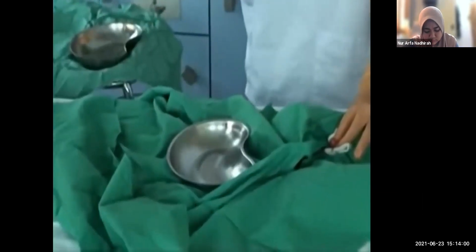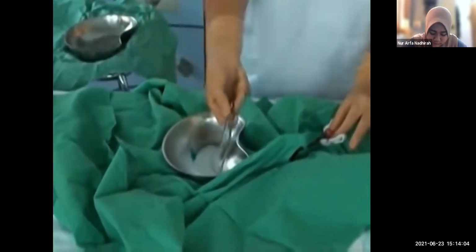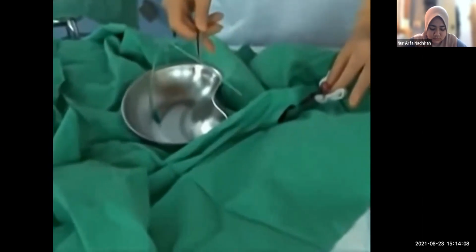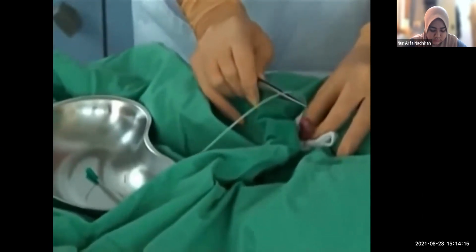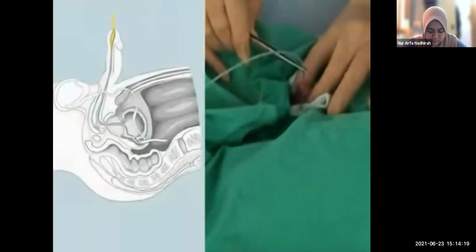Place the catheter in a sterile container within the sterile field between the patient's legs. The entire procedure can be done using your fingers or forceps with your dominant hand. First, we will demonstrate the procedure when using forceps. While holding the penis in a vertical position, slowly and gently insert the tip of the catheter into the urethral meatus. Slowly advance it into the bladder.